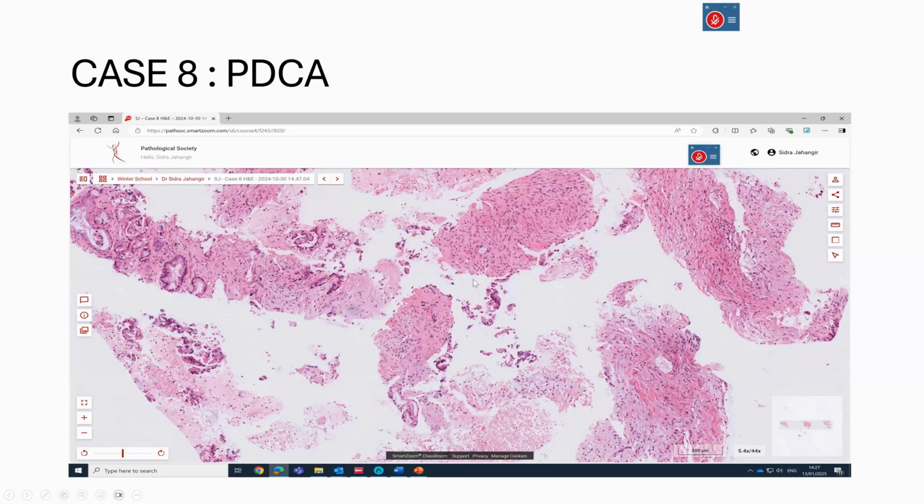Again, just a last case to show you a pancreatic ductal adenocarcinoma, because this is the most common entity. Although it's the most common, it's not easy to diagnose in most EUS specimens. Pancreatic ductal carcinoma is a stroma-rich tumor. You can have a lot of stroma with few ductal infiltrates. If you get just this material on your FNB slide, you can't diagnose it. At the end, you will call it non-diagnostic, although it's a part of the tumor.